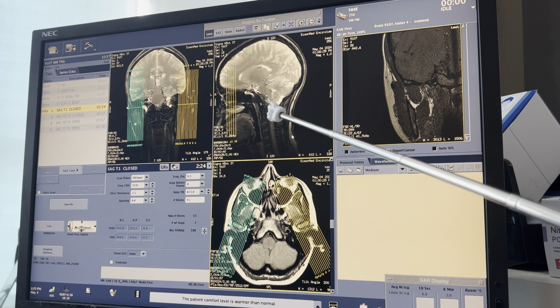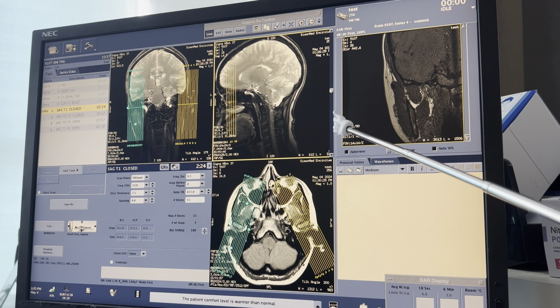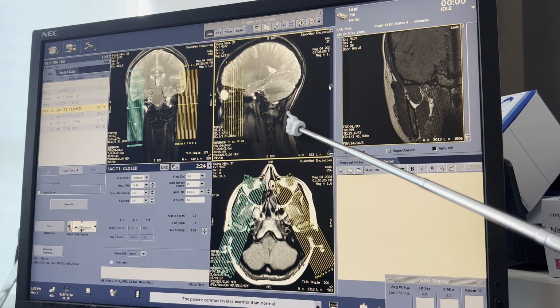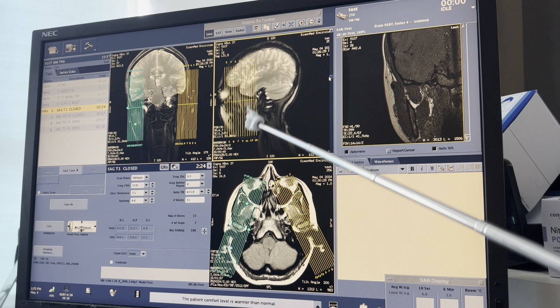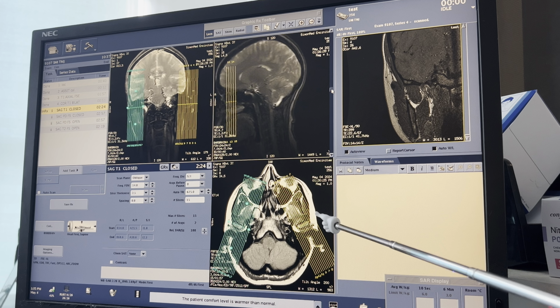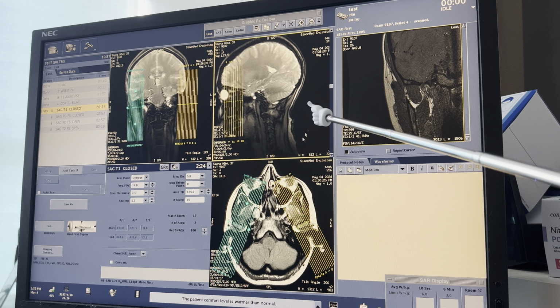Sometimes radiologists do want you to angle with the mandible, so scroll down. Let's go up, I guess. Yeah, might as well. A little bit more. Sometimes radiologists want you to kind of like angle with the ramus of the mandible, which will go down like that way. For now, just for simplicity's sake, we're going to keep it straight how it is.